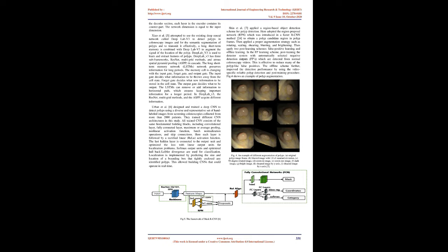The FCN8s architecture with VGG16, a CNN classification net, is adopted as a region proposal net. The VGG16 net is composed of 5 stacks followed by 3 transformed convolution layers, where each block contains several convolutional layers, a ReLU layer, and max pooling layers. The FCN8s produces more detailed segmentation compared to the FCN16s. However, some false positives may be present due to the lack of spatial regularization in FCN. Here FCN8s was trained with 2 classes, polyp and non-polyp (background), given by the ground truth images. FCN8s is trained using MatConvNet, which is commonly used as a deep learning framework.